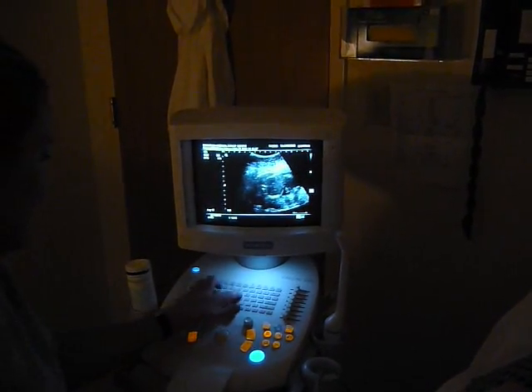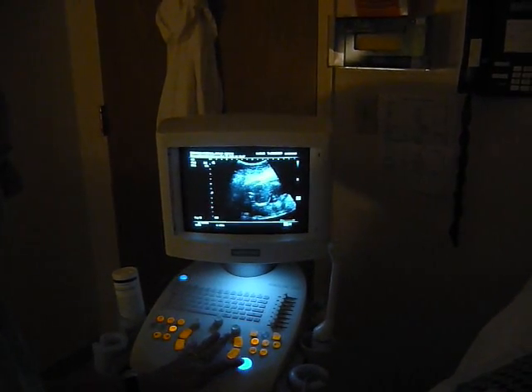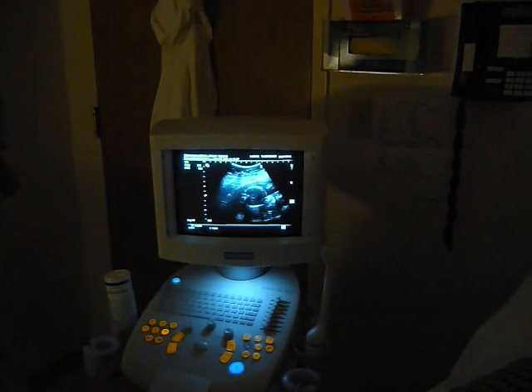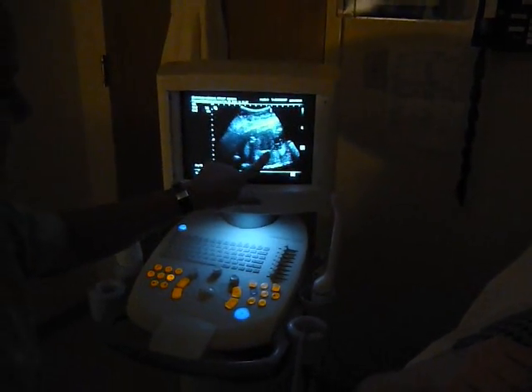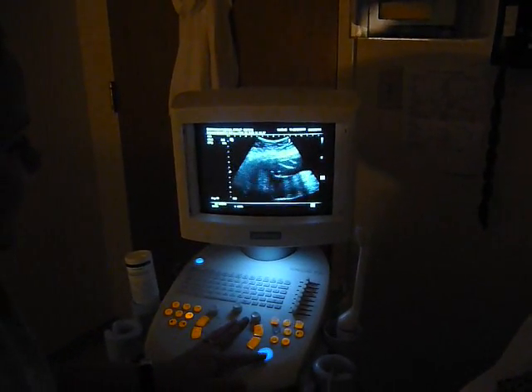Either side of the spine there. It's subtle and hard to see. How do you catch it? I just know where I'm at in the right level. They're trained, yeah. Heart, stomach, and then just a little bit further, there's a little darker shade of gray. And then down in the pelvis.